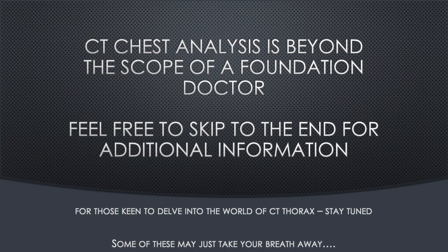So CT chests are not something you would, as a foundation year doctor, be expected to read in any capacity. So if you feel like this has been more than enough and you want to just get a few hints and tips and see the feedback area before you leave, then please do skip towards the end. But for those keen to explore some CT chests, stay tuned.